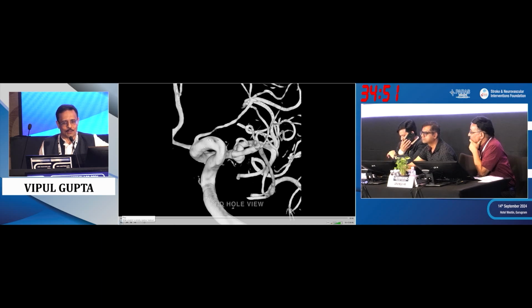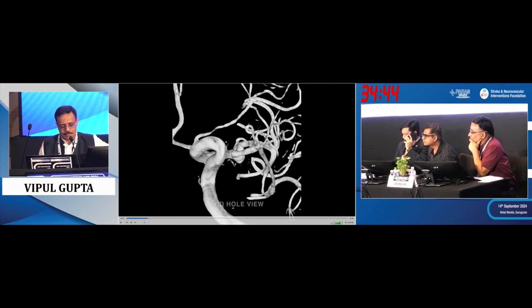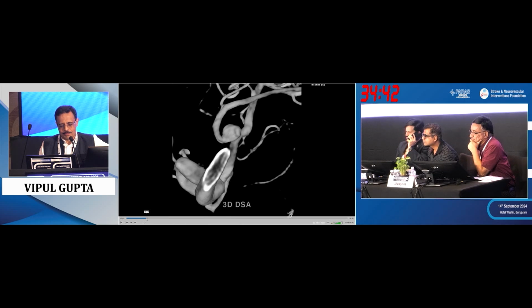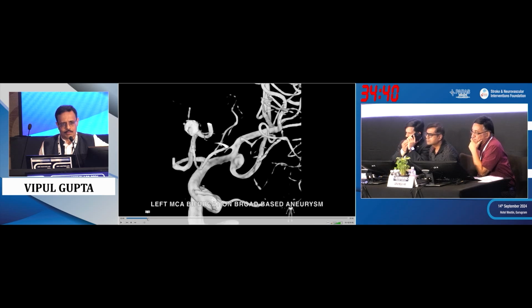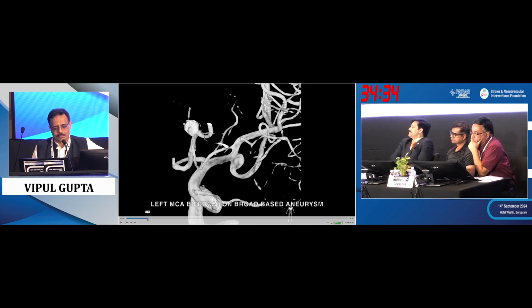And Vincent, how would you treat this one? For me, it would be an oversized Atlas plus coil in the inferior branch. When you oversize the Atlas to 4 mm, 4.5, it's just an unsheath maneuver, and you can protect 2 branches with just a simple maneuver, and then you just coil.